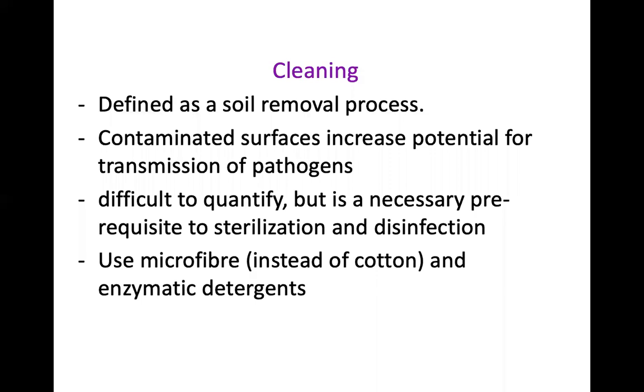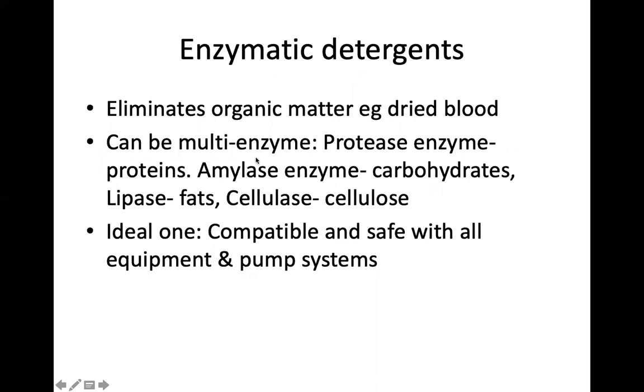So you may need to clean your medical items, forceps, etc., before you disinfect or sterilize them, or you may need to clean environmental surfaces that are contaminated with medical waste. And for all of these processes, you need to use enzymatic detergents, okay? Besides using the enzymatic detergents, you may need a material which you soak into the detergent and wipe surfaces. What is preferred right now is microfiber material instead of cotton. Okay, so let's look at these enzymatic detergents.